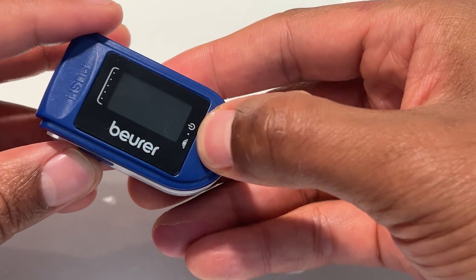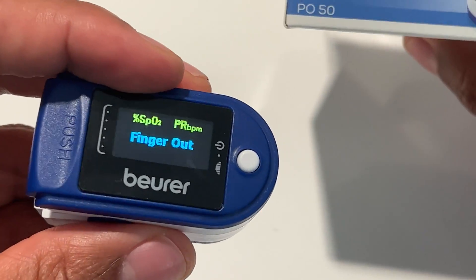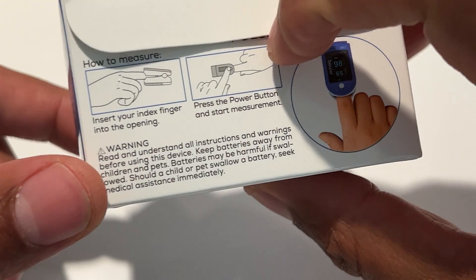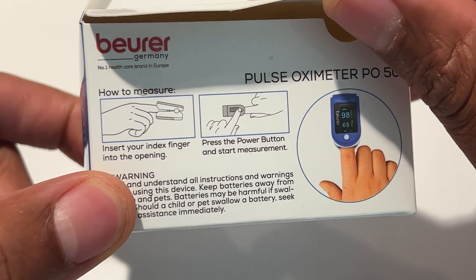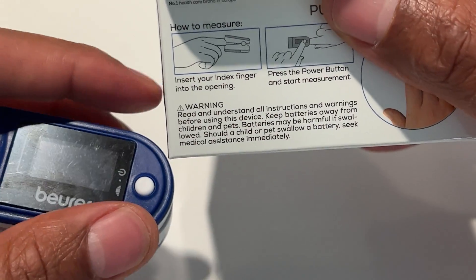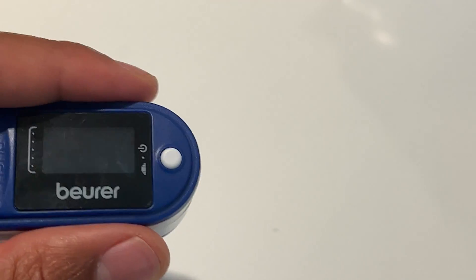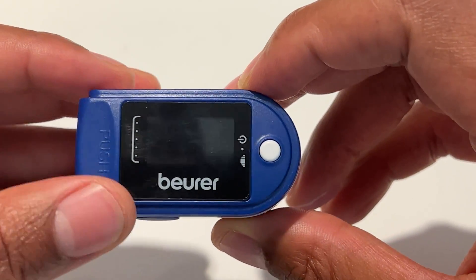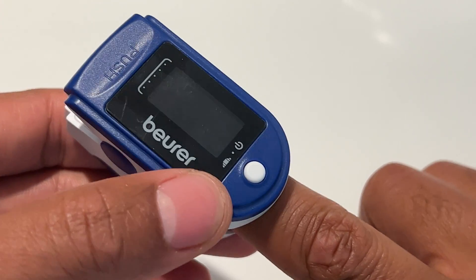And it's on. Press the button and it says "finger out." So the finger is out. The instructions on the side say: insert your index finger into the opening, press the power button and start measurement. It's turned off automatically. It also says to read and understand all of the instructions and warnings before using this — very important.